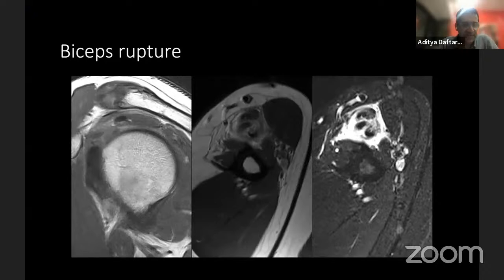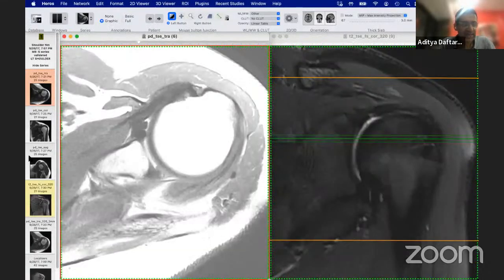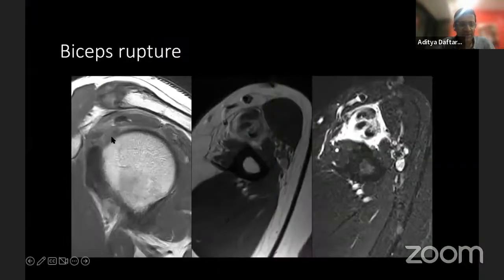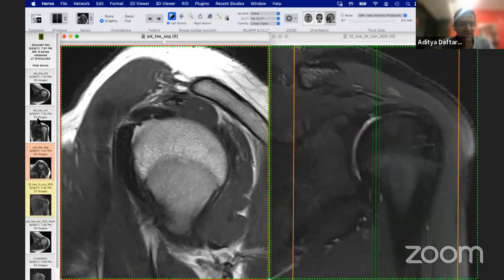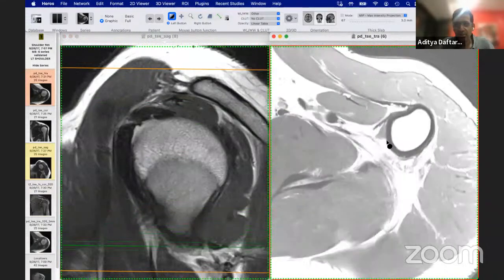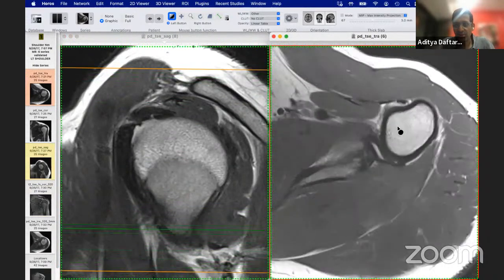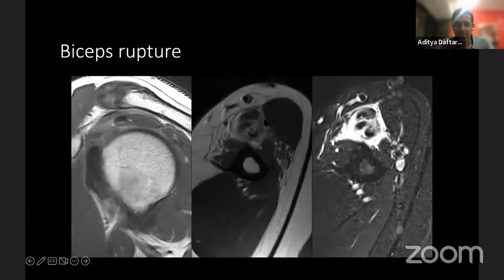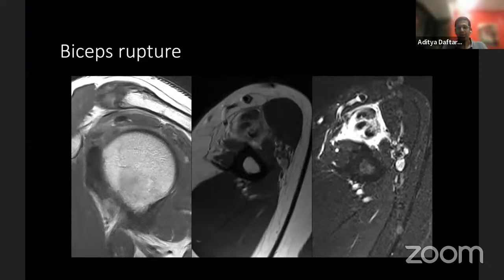Here's our first case. On the sagittal images, you can see the long head of the biceps just between the supraspinatus and the coracohumeral ligament. Instead of a dark black structure, we see just a small gray nubbin. On the axial images, you would expect to see the biceps going down to the myotendinous junction, but here you don't see any biceps and the muscle is all balled up — this is a proximal long head biceps tendon rupture.